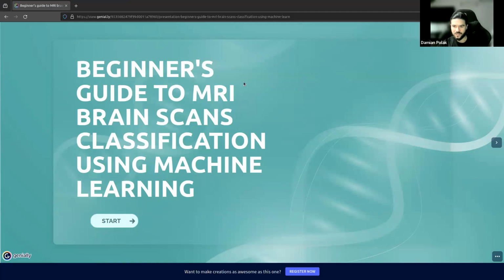This tutorial is based on my experience gained while working on my master's thesis, which focused on the automatic classification of MRI scans for Alzheimer's disease prediction. The entire project for my master's took about 1 year of work, and I'm really grateful for the opportunity to share this knowledge here with you at the Data Science Conference.